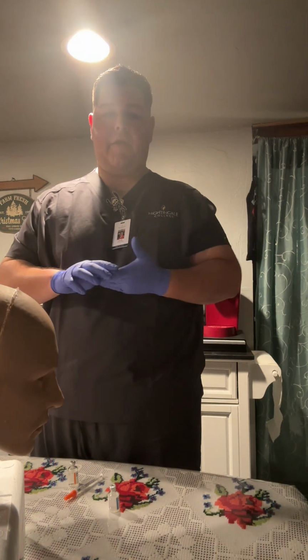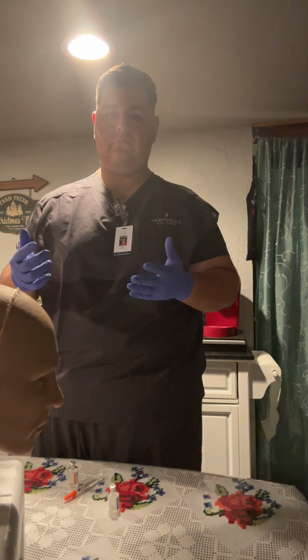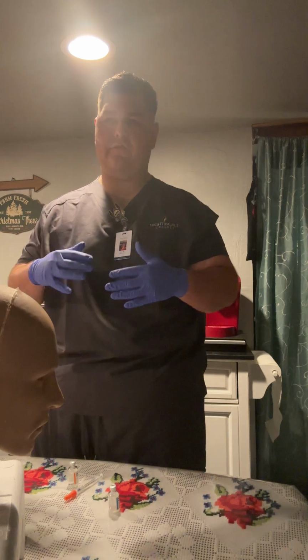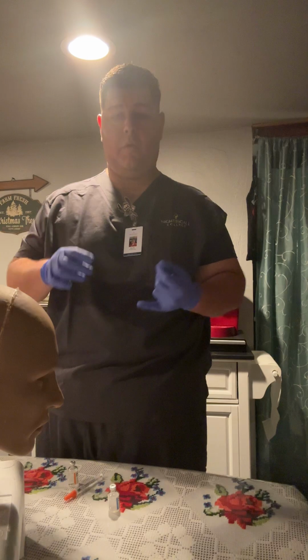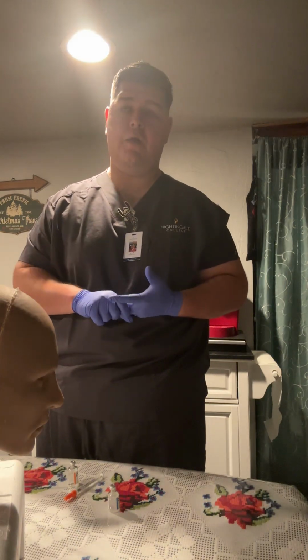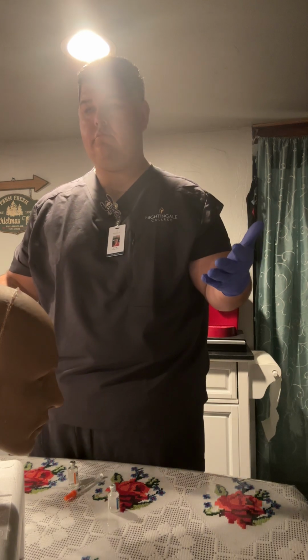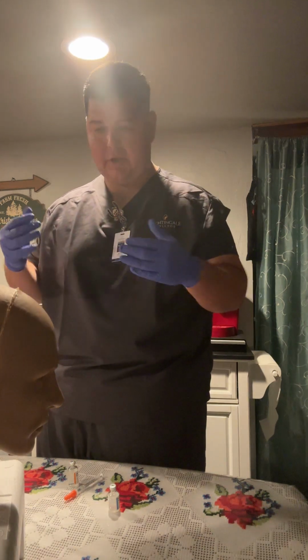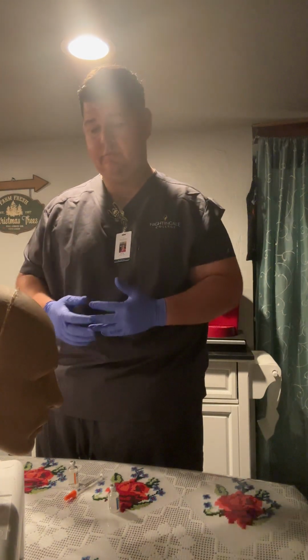I wanted to point out that if I was preparing the medication outside of the room or away from the bedside, I would be labeling my syringe with the patient's name, the dosage, and the amount, so that if I were to mix up the syringe, I can point out who it belongs to, and then move forward from there.